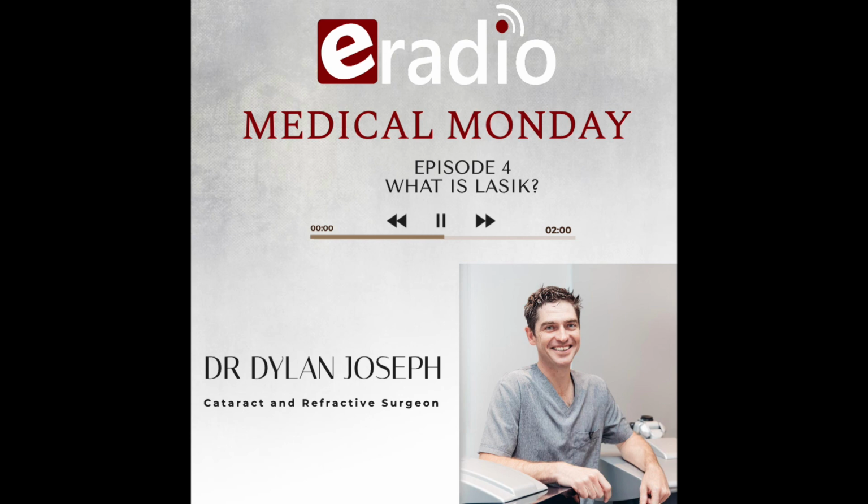One of the predecessors of laser to correct something called short-sightedness or myopia was a procedure called RK, radial keratotomy. I'm not sure if you've heard of that, but it was done on thousands and thousands of people in the 70s and 80s, and it worked very well. But the problem is it actually changes the shape of the cornea quite significantly, and it can change the optical quality, and some of them were left with scars. And what we do now is we can actually measure the thickness of the epithelium. As I said earlier, we can tell the laser to remove that and remove the scar to get a better optical shape and to hopefully improve their visual outcomes as well.